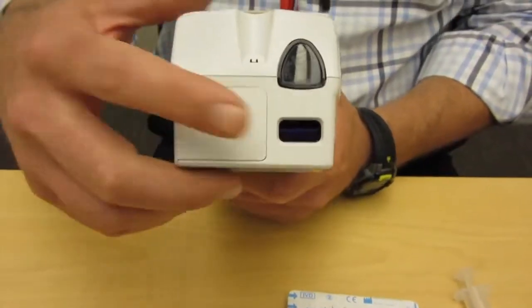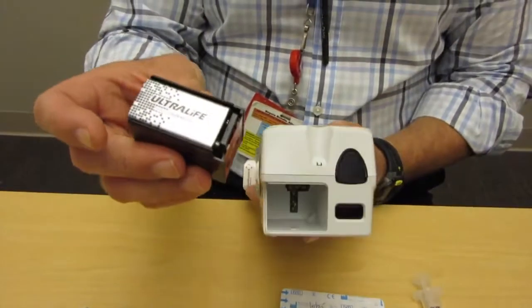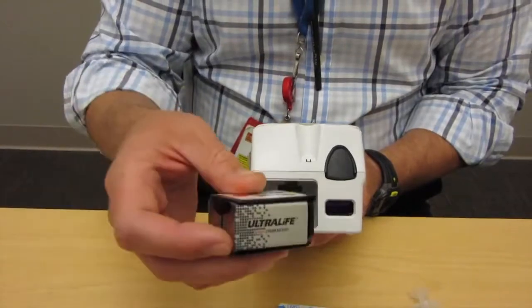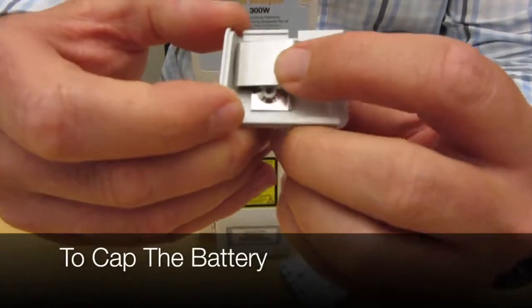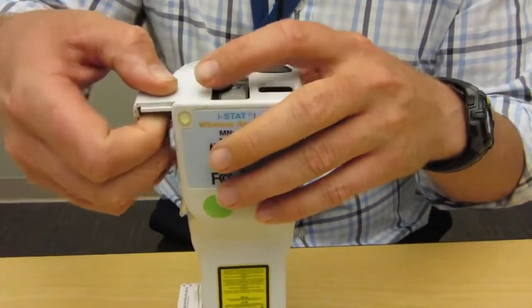At the top, we have our IR port and our special battery compartment, where we have our non-standard Ultralife lithium batteries. These are not standard batteries — that may be a test question. To open the compartment, you have to push this tab in firmly in order to get it to slide up and over.